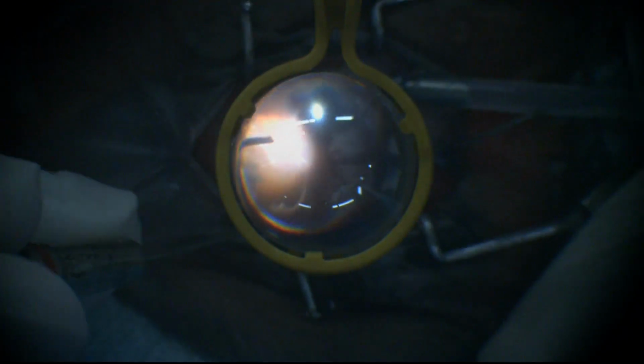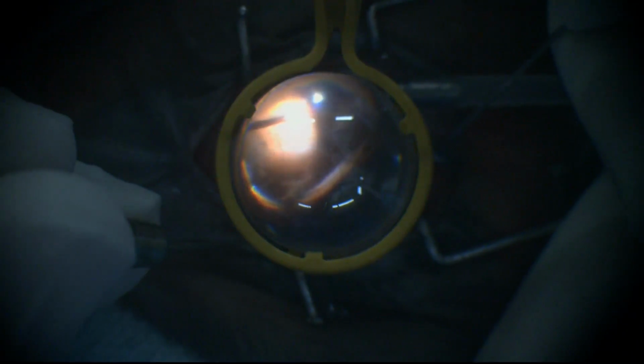I've never understood. No, we are replacing fluid which is gravity fed. So once there is hypotony, the fluid will move as per the pressure in the infusion line. So the fluid will move from a high pressure area to a relatively low pressure area. It will replace that.